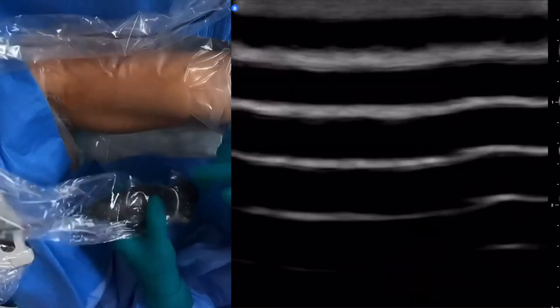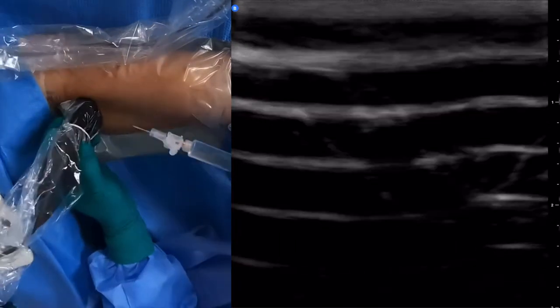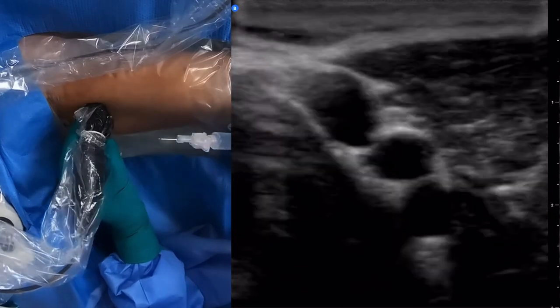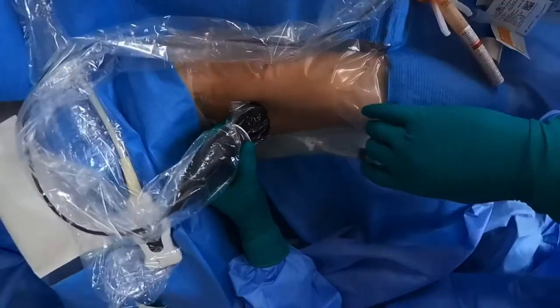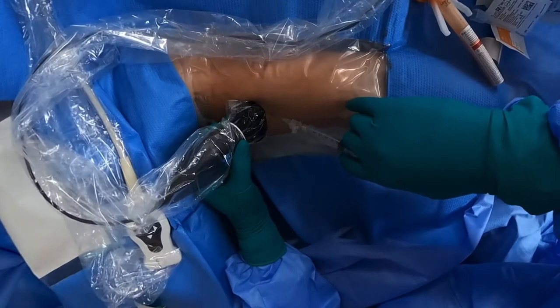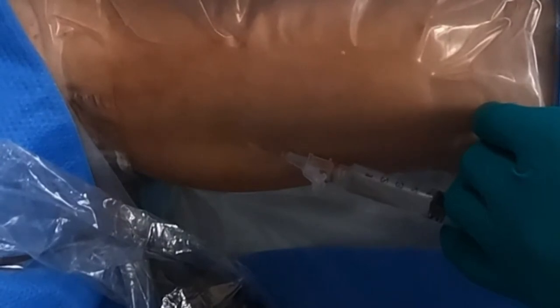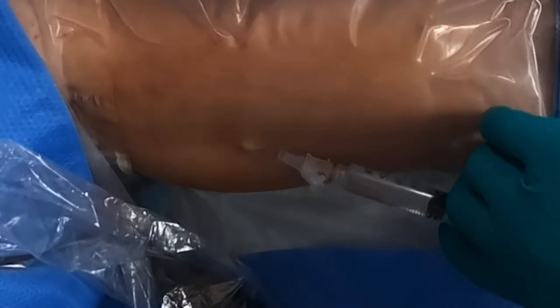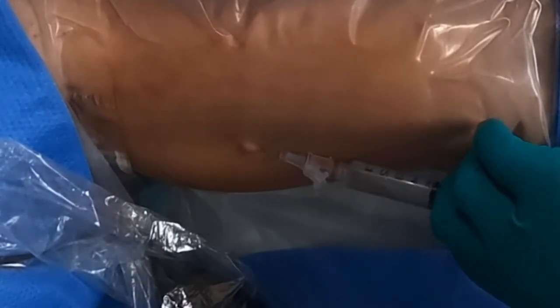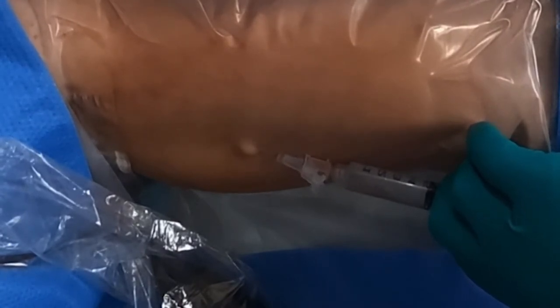We're going to numb him up right now. Let that medication sink in — are you ready? Okay, here we go — three, two, one, stick. This is the intradermal wheal where we're going to numb this locally. Any pain? Nope. No burning at all. Good. Going slow, taking my time.